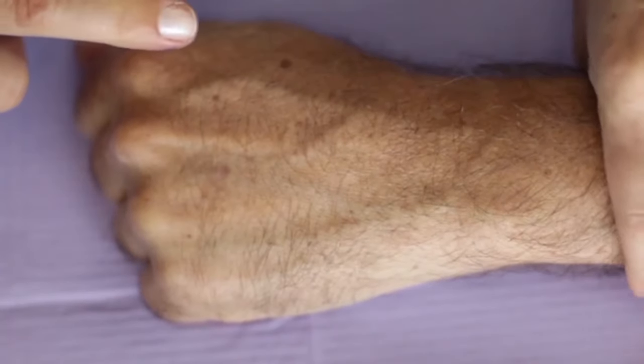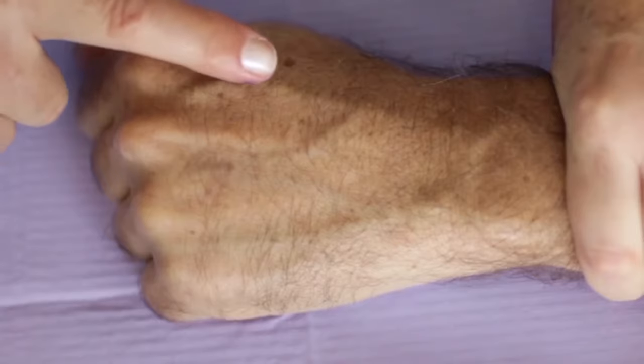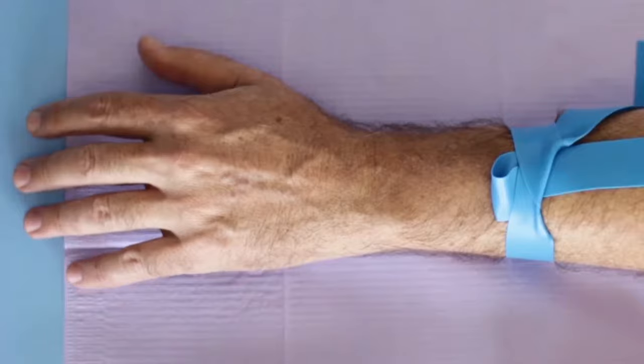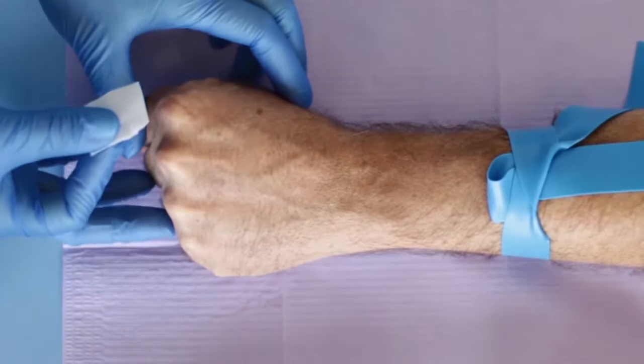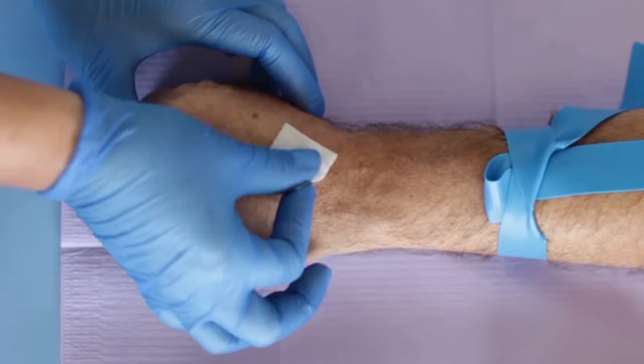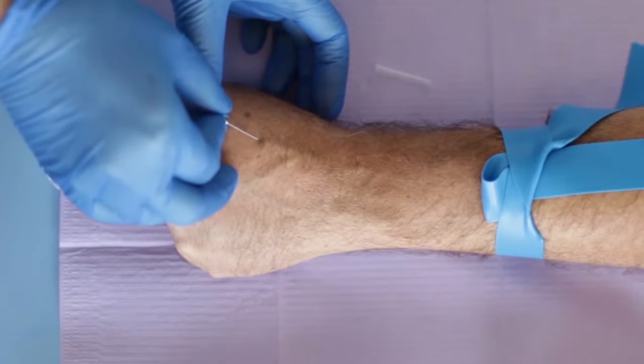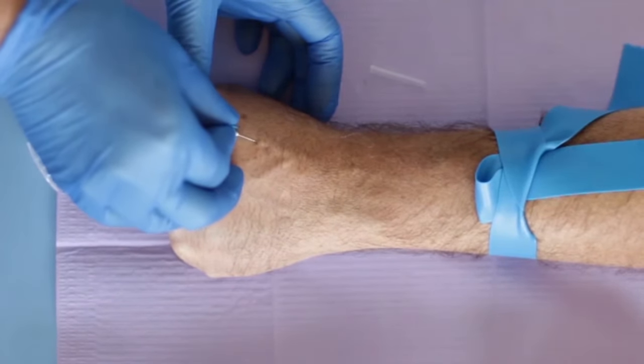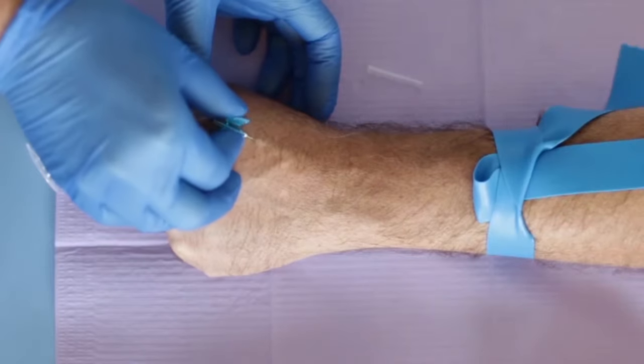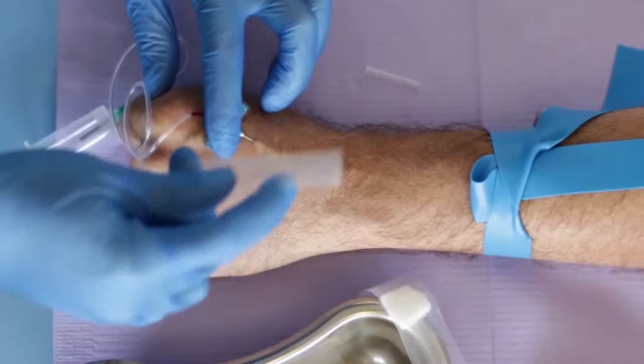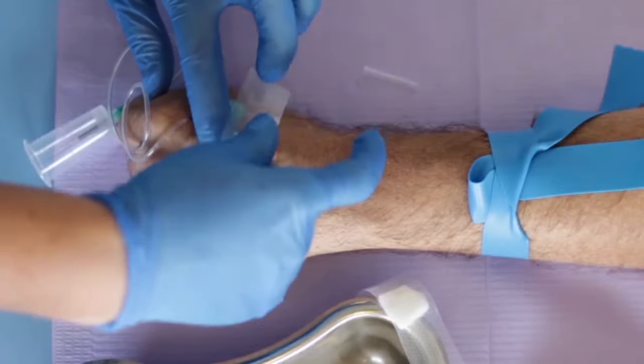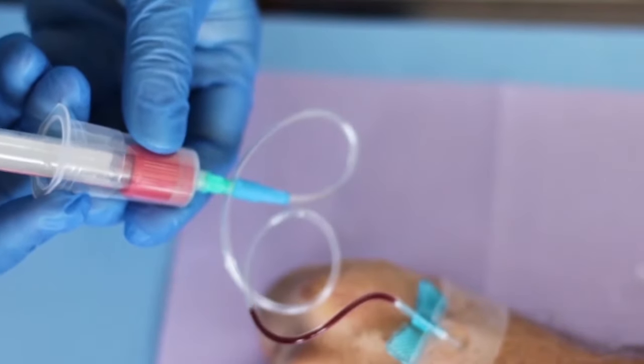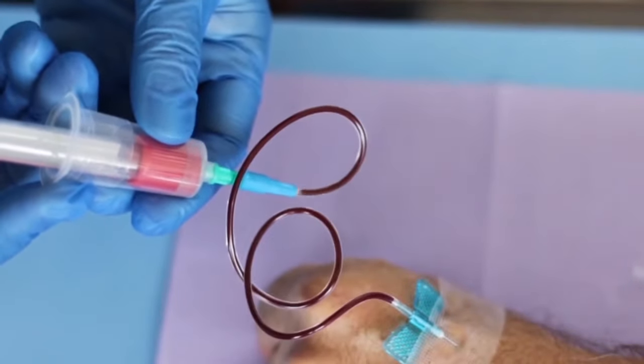View a clinical example of this procedure. You may notice slight differences in the procedural steps due to individual preference or variation in protocol.